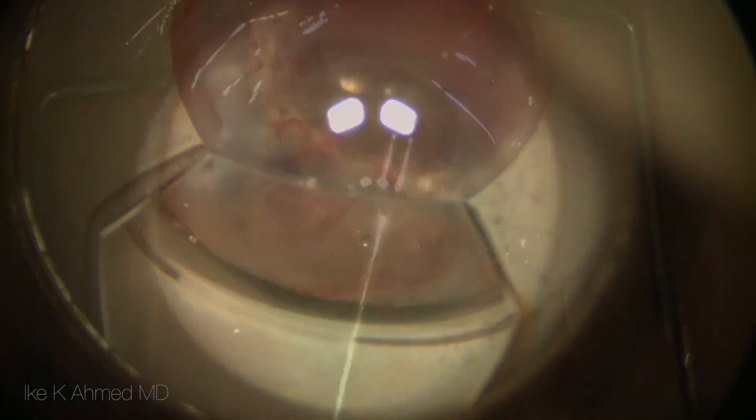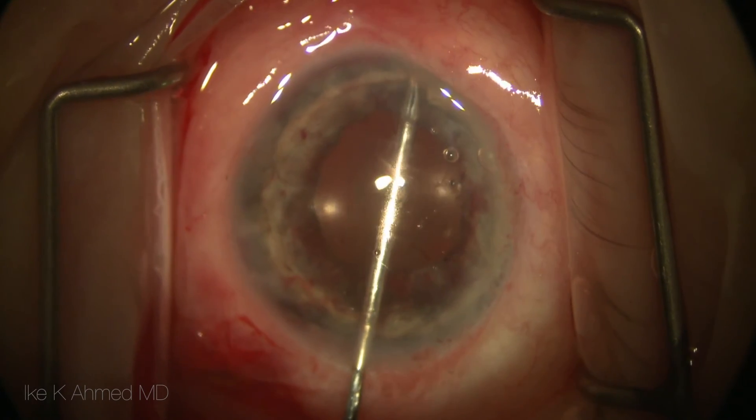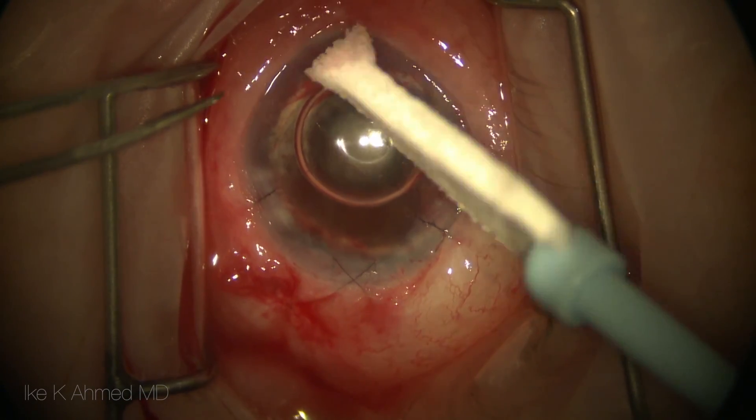Goniosynechialysis is performed using an indirect view with a pair of micrograspers to release the synechiae and open the angle. The case is then concluded with suturing all the corneal incisions.